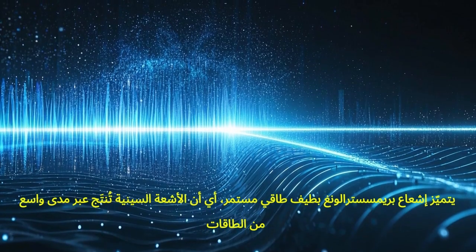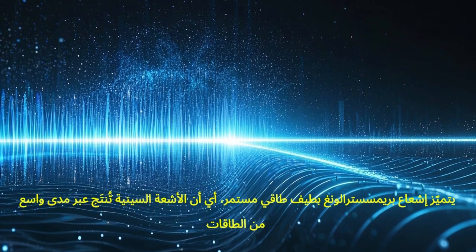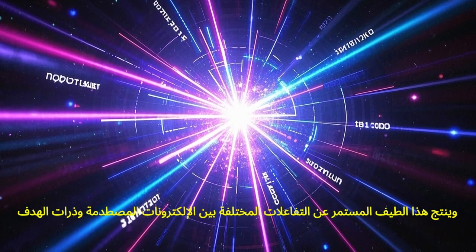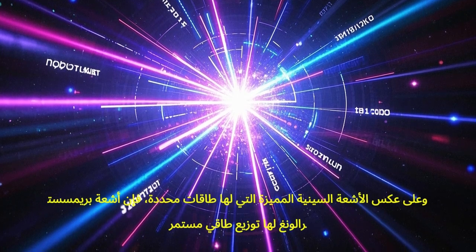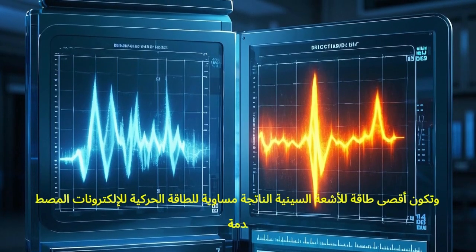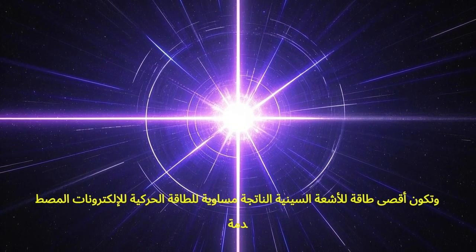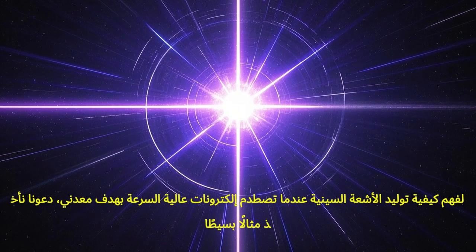Bremsstrahlung radiation is characterized by a continuous energy spectrum, meaning that X-rays are produced over a range of energies. This continuous spectrum results from the variable interactions between the incident electrons and the target atoms. Unlike characteristic X-rays, which have specific discrete energies, Bremsstrahlung X-rays have a distribution of energies. The maximum energy of the X-rays produced through Bremsstrahlung radiation is equal to the kinetic energy of the incident electrons.